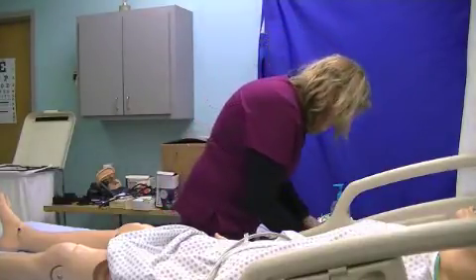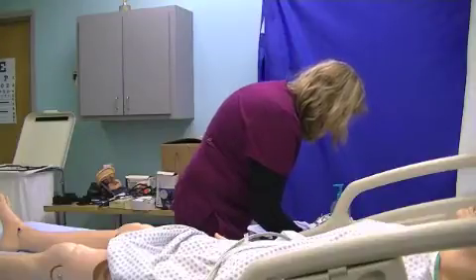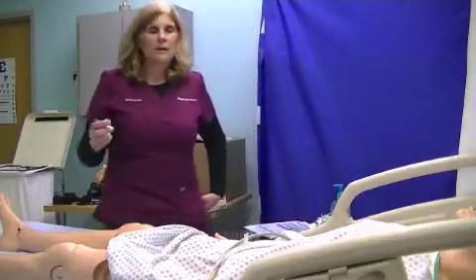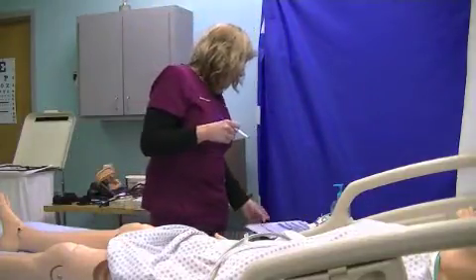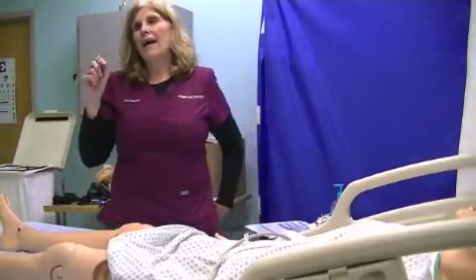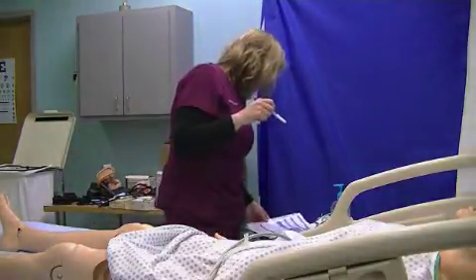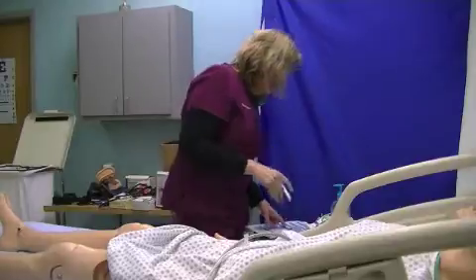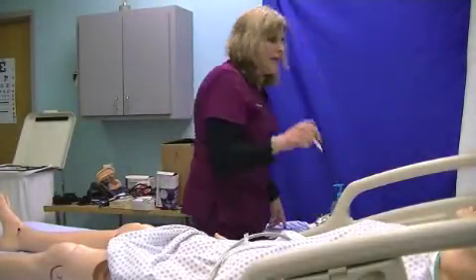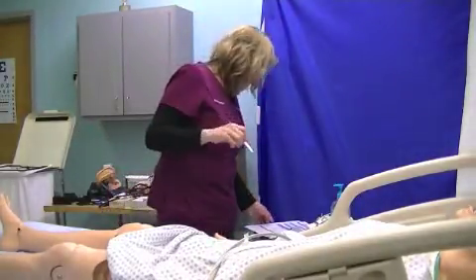Okay, so I'm going to document here 99.0 degrees Fahrenheit, and I took it orally. I don't need to note oral, but if I used another site, I would put R for rectal or AX for axillary, and for oral I just put the temperature in degrees. And I'm going to check the baseline, what the original temperature was, to see if he has any pattern of the temperature going up or down.